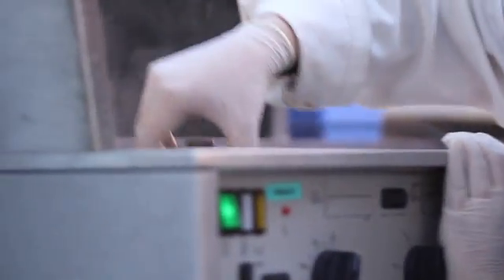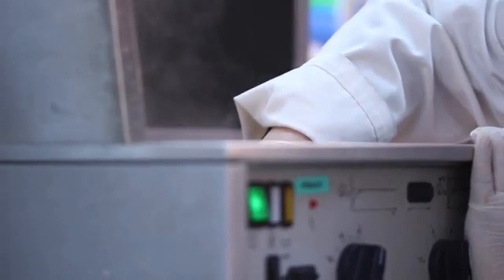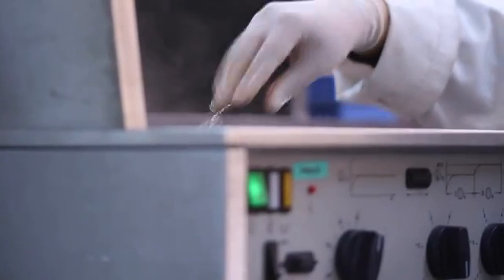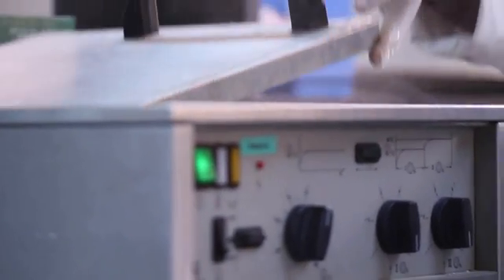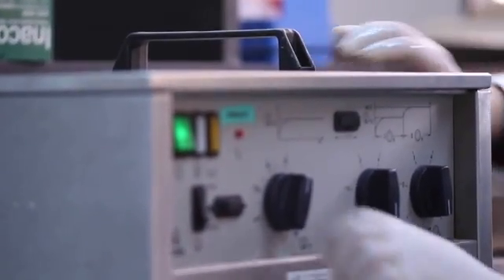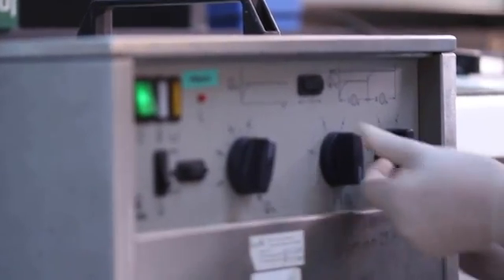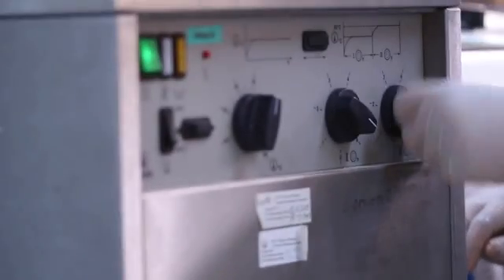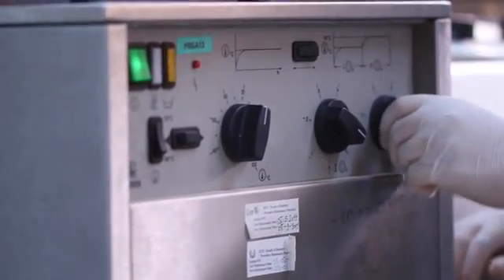The long cure cycle involves placement of the denture flask and the carrier into a curing unit filled with room temperature water. The water temperature is raised slowly to reach 74 degrees Celsius in one hour. The temperature is maintained for an additional seven hours. At the end of this period, the water is brought to a boil and maintained for an additional 30 minutes.